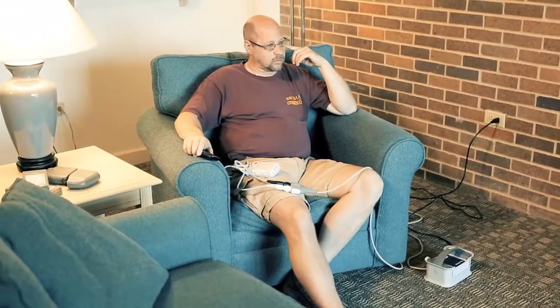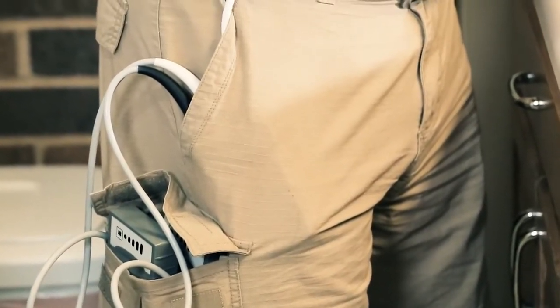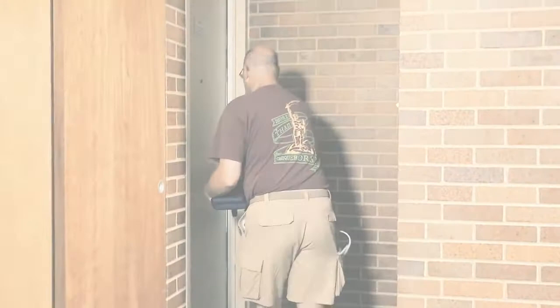Being constantly connected to wall power or a battery pack is also a huge adjustment for patients. The batteries weigh about as much as a gallon of milk. A patient can wear them on a belt or in a vest and must have an additional battery pack on hand at all times.